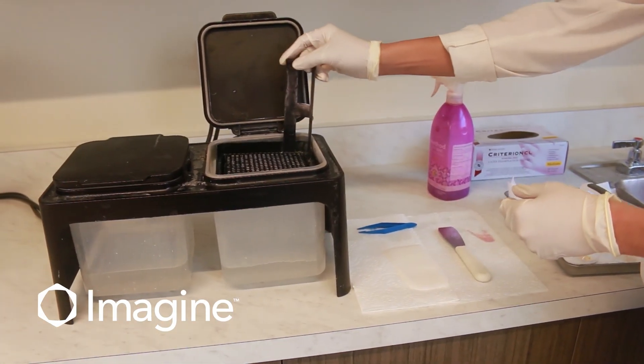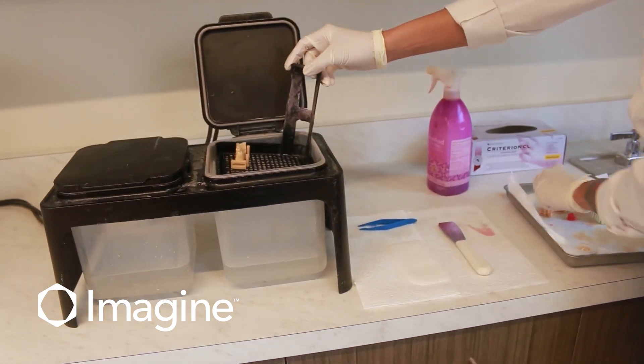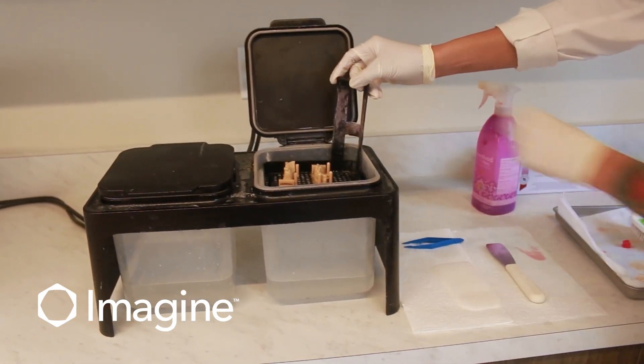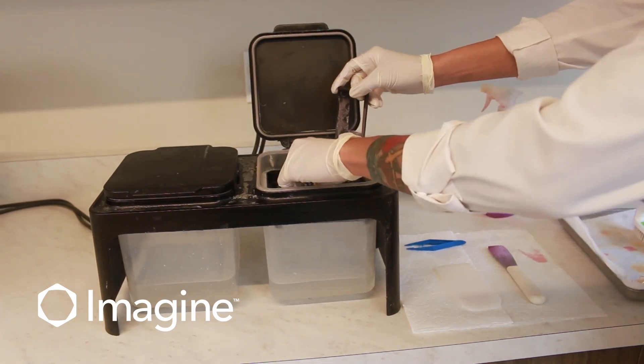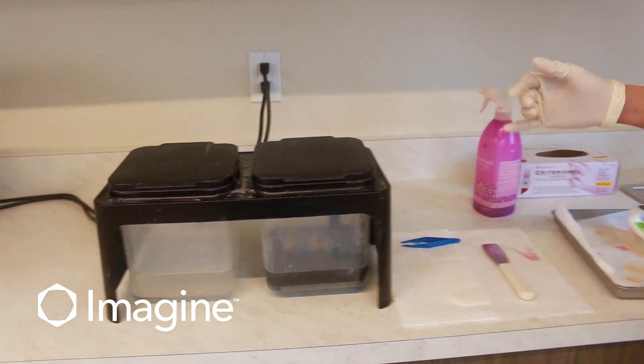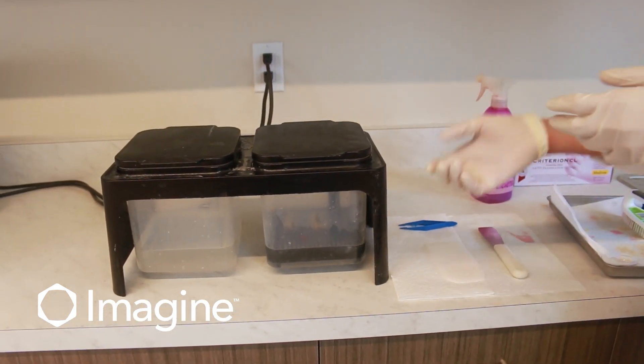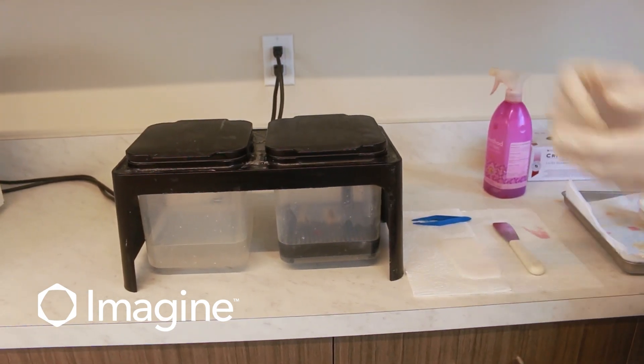Once our units have been brushed, we're going to take our bath container, place those in there, and slowly lower it down into the alcohol, and we'll wait. If you don't have a lot of alcohol in your bath, no worries — just take your units out and flip them in a few minutes.